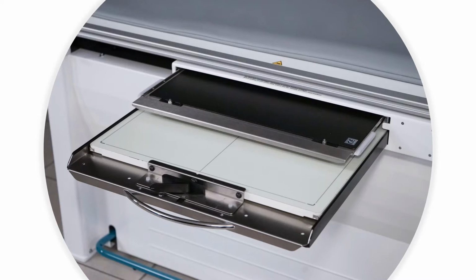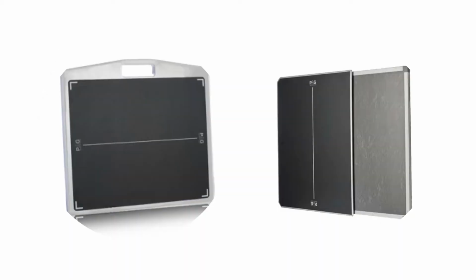Your equipment, such as a table or wall bucky, could have a grid either permanently installed or give you the ability to swap out different types of grids depending on what you're going to image. You will also use grids when taking portables. These grids fit on top of the image receptor. Grids come in all sorts of sizes, material, and types.